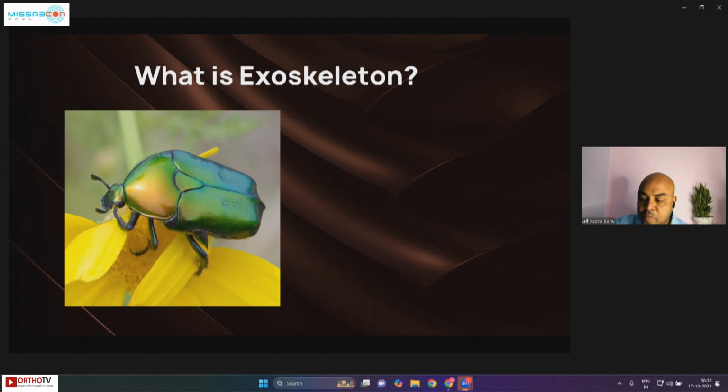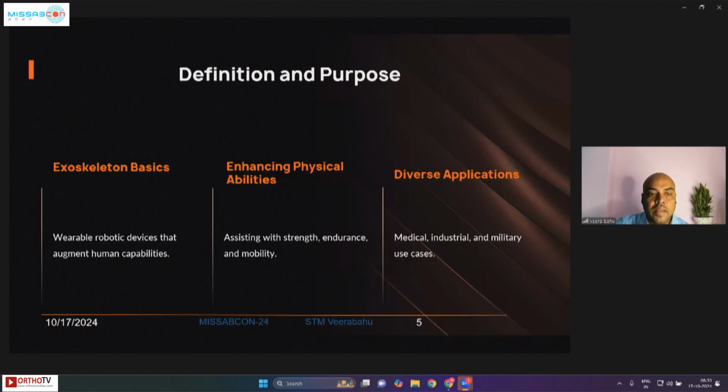So power is delivered either by an electrically activated system, or it can be a passively activated system. And then when you structurally give some kind of strength to these platforms, you have a rigid element in the picture. So this is what would probably make you develop an exoskeleton. But in general, these are basic, natural systems that you try to mimic. So this is just an example.